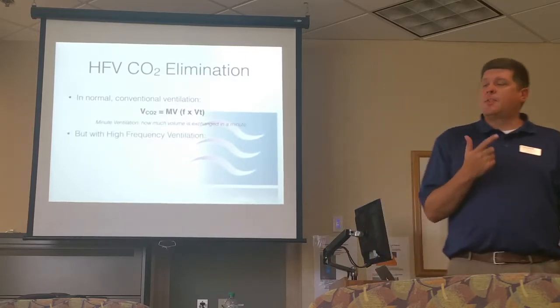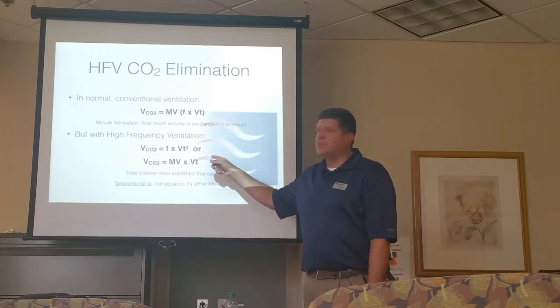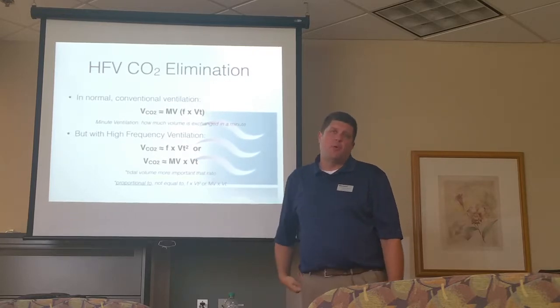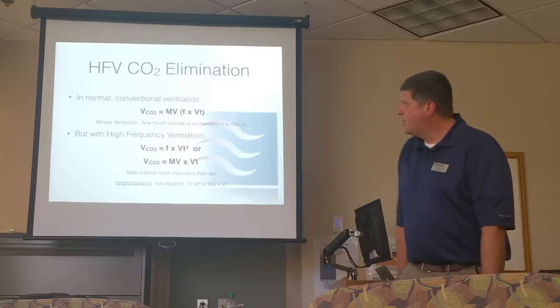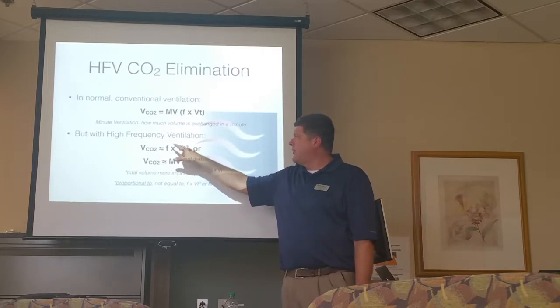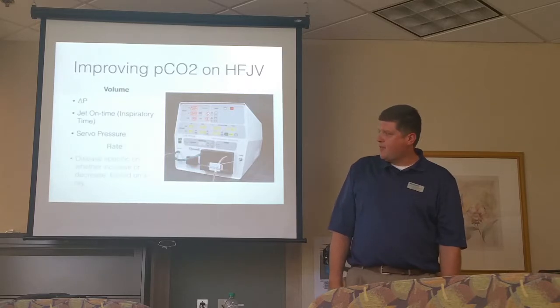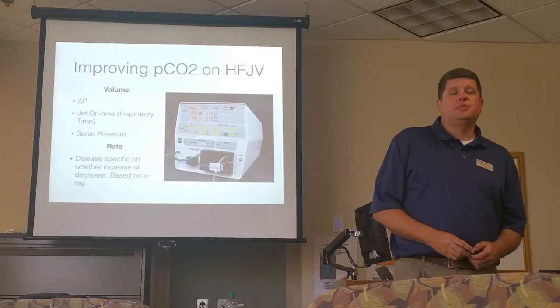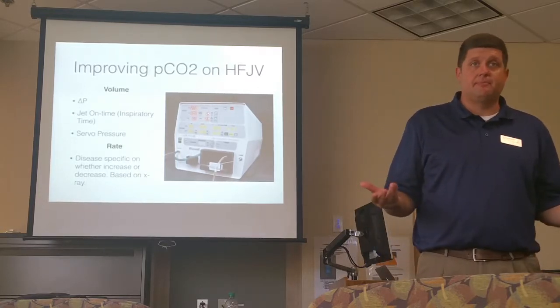All right, so now that we've got oxygenation down, let's talk about ventilation, and that's about the jet. With high frequency, remember our CO2 elimination formula changes a little bit. It's no longer just equal to your minute volume. Your CO2 elimination is now proportional to rate times tidal volume squared, okay? And what that essentially means is that any tiny change that I make to my volume delivery will have a much, much more profound effect on my CO2 elimination than changing the rate ever will. So the most efficient, the best way to change volume delivery on the jet is to simply increase the delta P. You go up on the jet PIP, okay?